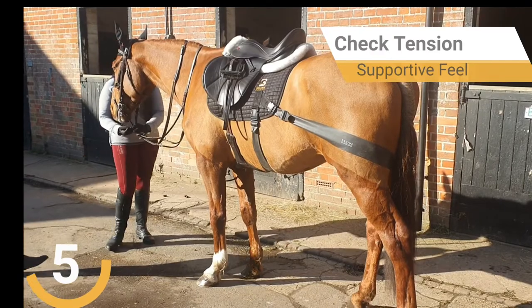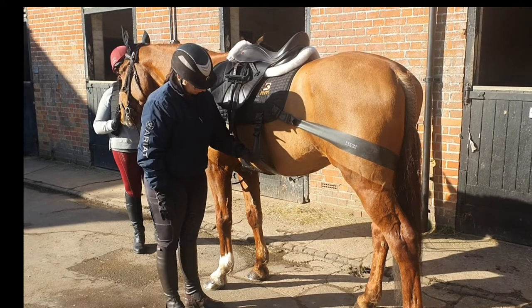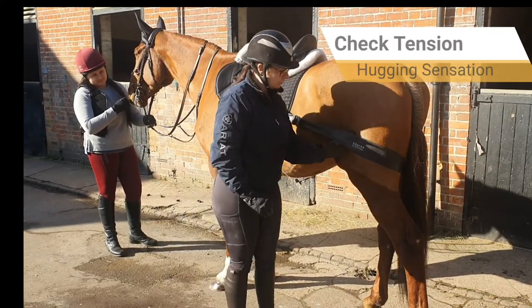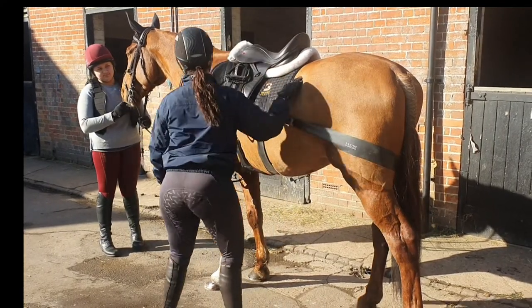Step 5. Check that the bands are secure and check the tension by sliding a hand between the horse and the band. You should experience a supporting or hugging sensation. If your hand feels either unsupported or too restricted, recheck the band tension.